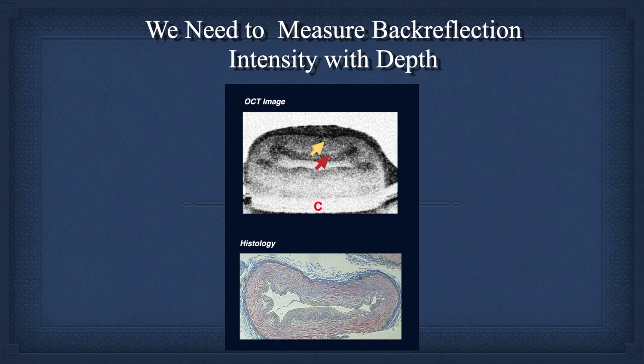So with time domain, in a single A scan, we collect backscattering data as a function of depth, analogous to ultrasound. With the other two techniques, we're just going to take the entire A scan and measure all the frequencies, and then we'll see what we do with that later. But that's the difference. SS-OCT is not analogous to ultrasound.